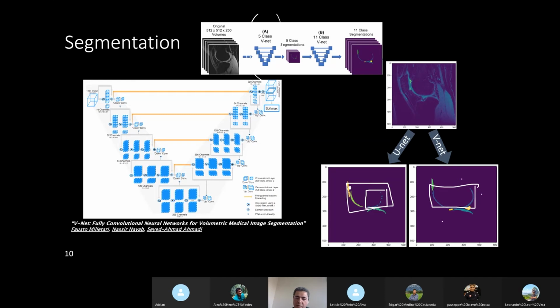I just account for the biggest connected component. I clean everything else, and then I do the cropping. That improved a lot the accuracy of my bounding box, actually. But that region, that rectangle, you are drawing manually, right? Yeah. I think that was part of the question of Oscar.